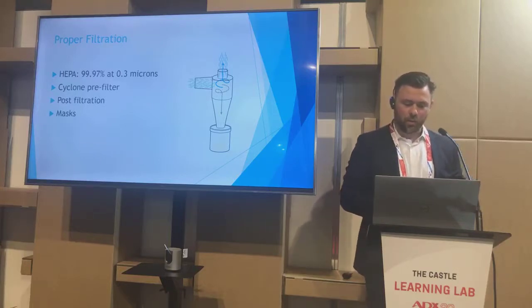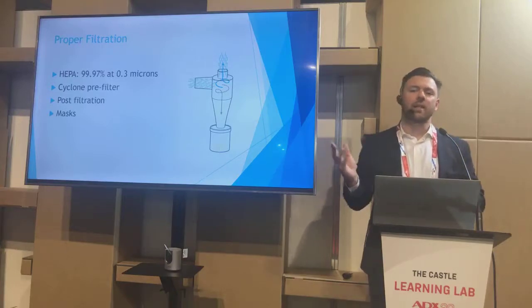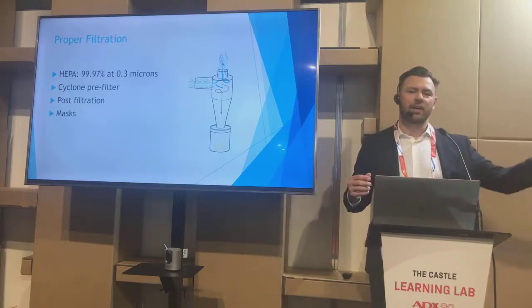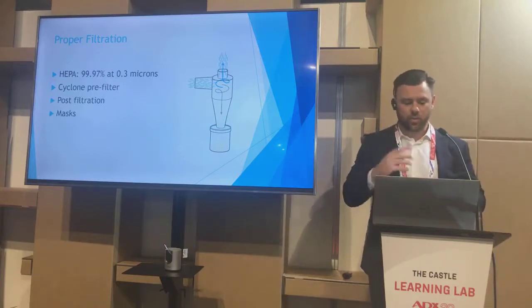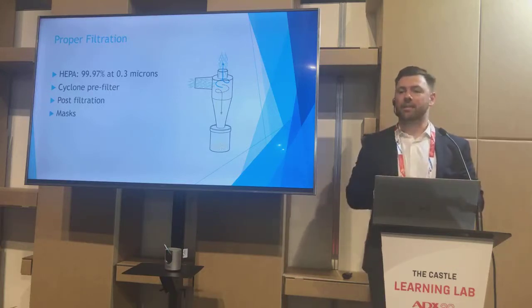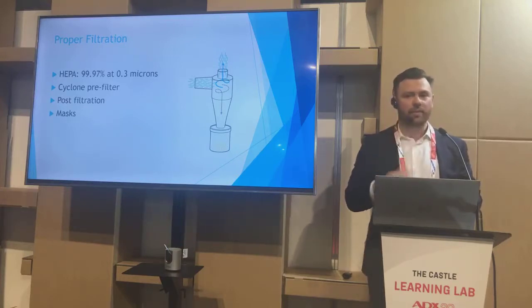Post-filtration, it's very important to have some sort of filter on the intake of the motor. You have a dust collector, all the dust goes into the system, but it's also important that the air coming out of the unit is filtered as well, so we can provide filtration there too. And then the last, of course, is just wearing a mask. It's not required in a lot of labs, but I think it's important that people know that wearing a mask is completely acceptable.